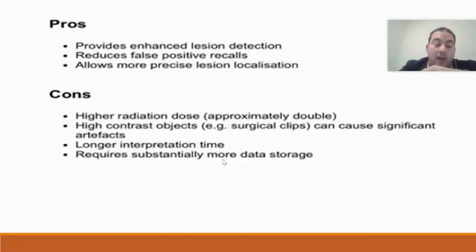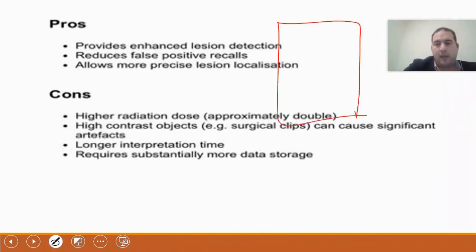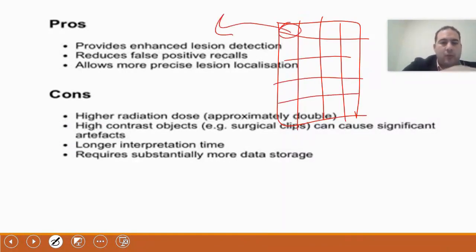Additionally, the image will require high storage capacity because, for example, you might take an image of 1024 by 1024 pixels, which is a high-res image. If we assume that each pixel is 1 byte, 8 bits, then, as I mentioned before, each pixel has a certain number of bits, which can be 8 or 12, depending on the number of gray values I want. Naturally, the higher this number, the better your grayscale will be, allowing you to differentiate between low contrast objects in the images.